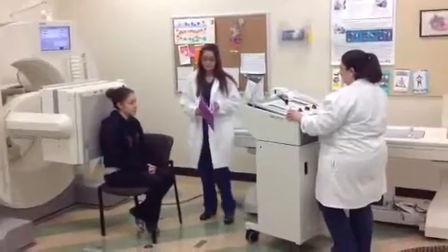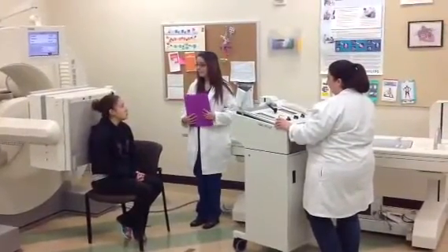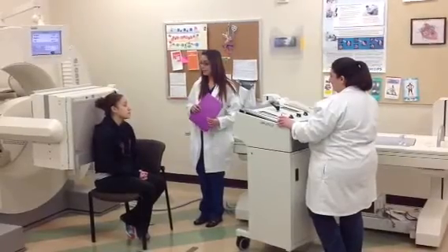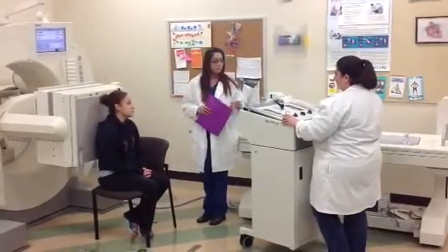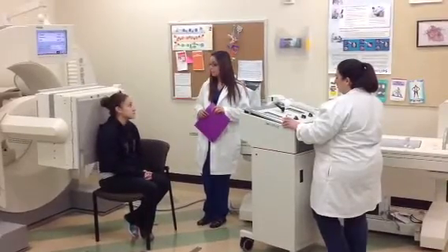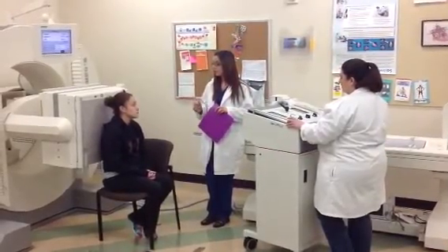Turn the power switch, located on the patient side of the unit, to on. Place the Pulmonex 2 as close to the patient as possible and set the handle to the start position number 1. Set patient airflow control to 30. Set trap airflow control to 0.